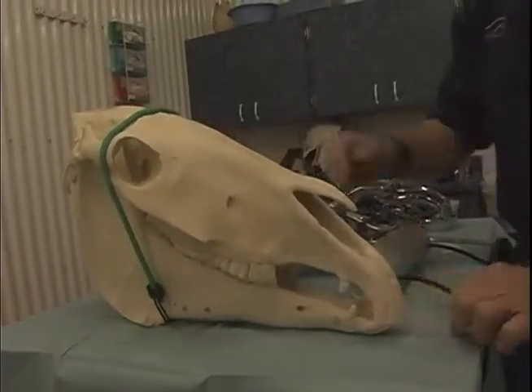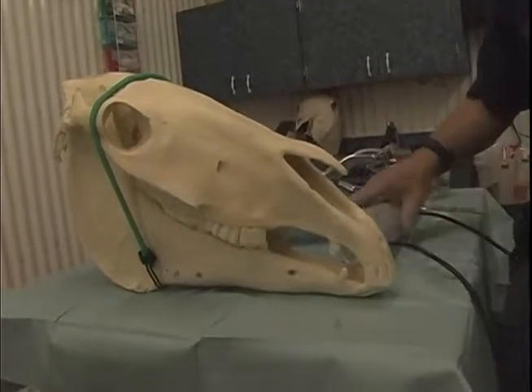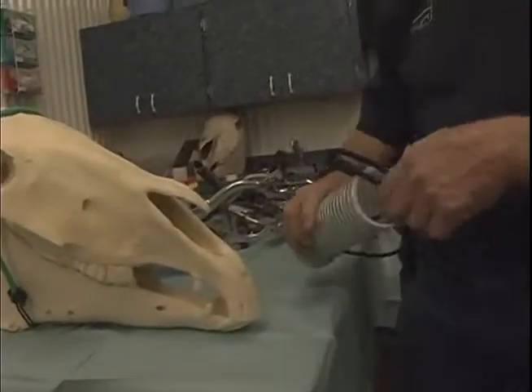Approximately 25% of horses will need a little bit of incisor work, so these mouth gags are very important to have.